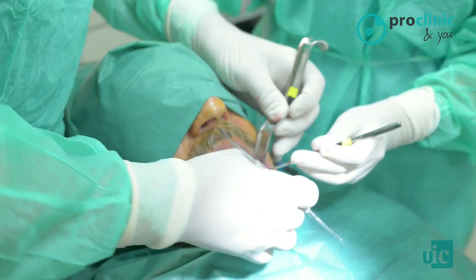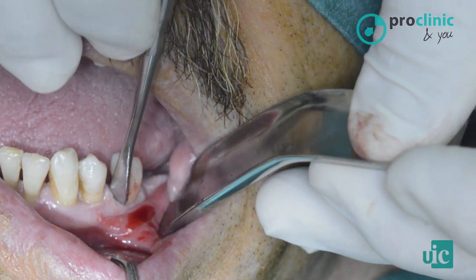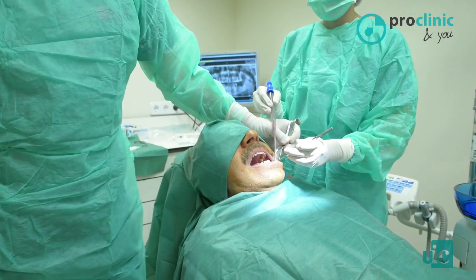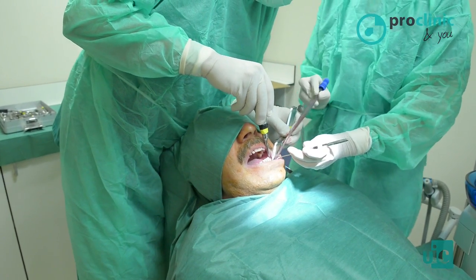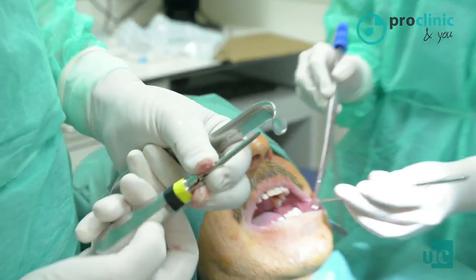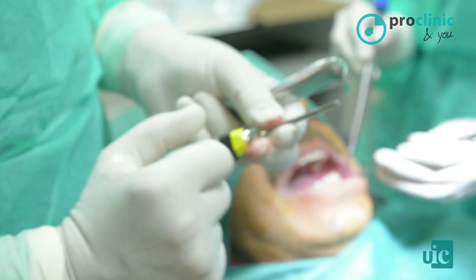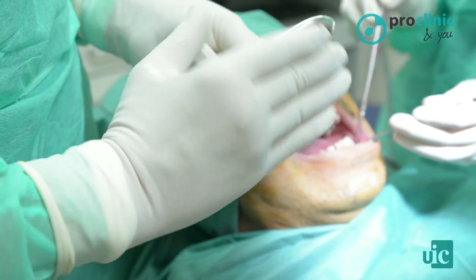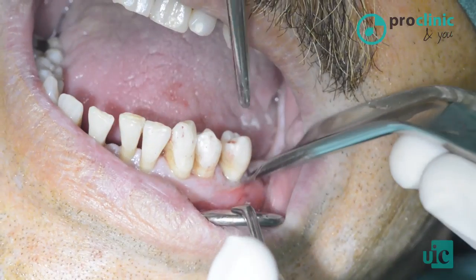Okay, so we continue. We introduce the straight dental elevator following the tooth axis. And we move the tooth a little bit with the active part of the dental elevator. The active part is the one which is concave. The channel, the grooved part, is the one that will be in contact with the root surface of the tooth. And the convex part is the one that's going to be in contact with the soft tissue, the gum. All right?